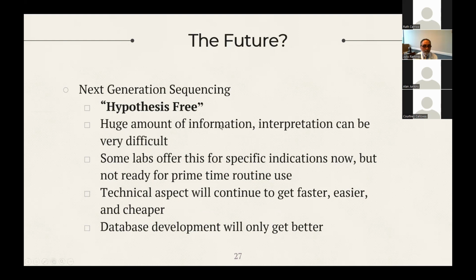It's a huge amount of information, so interpretation will be very difficult. It's going to be up to microbiologists to look at those charts, look at those reports, and kind of figure out what is the important organism here.